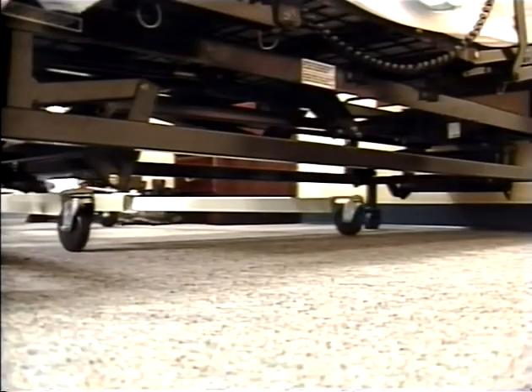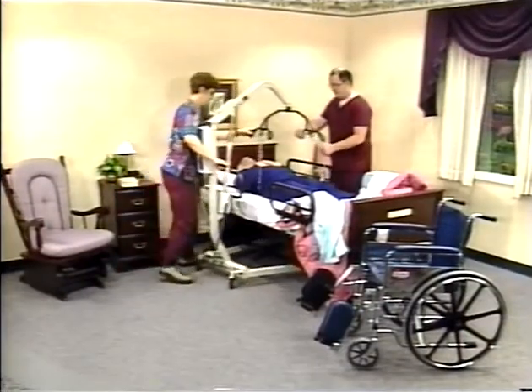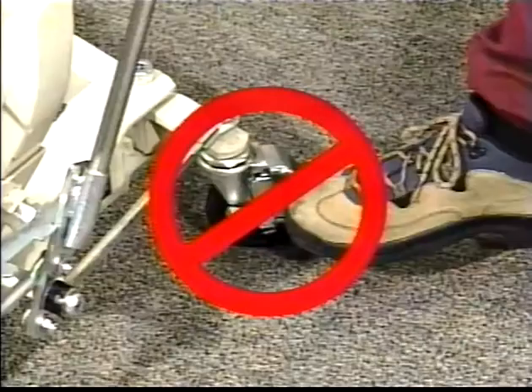Roll the base as far under the bed as possible, centering the cradle over your resident. Take care not to bump his head with the cradle while positioning it. Never lock the wheels during a lift either. The wheels must be free to center the cradle over your passenger.